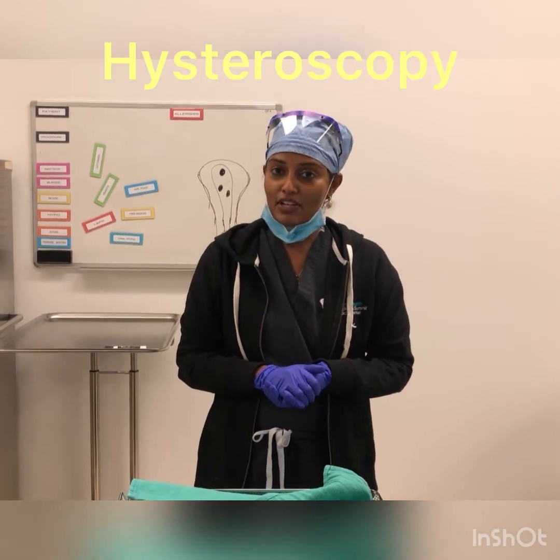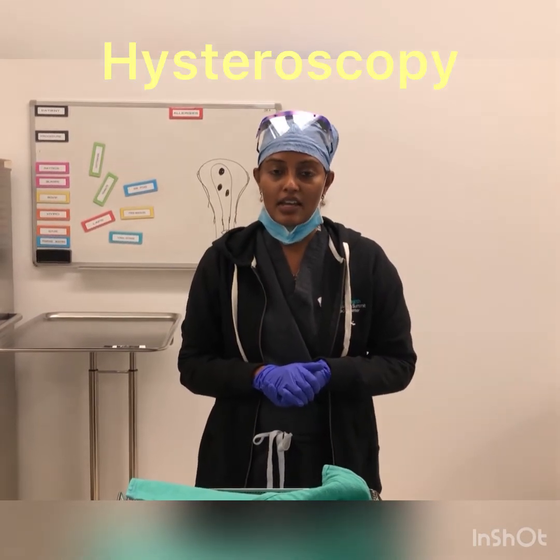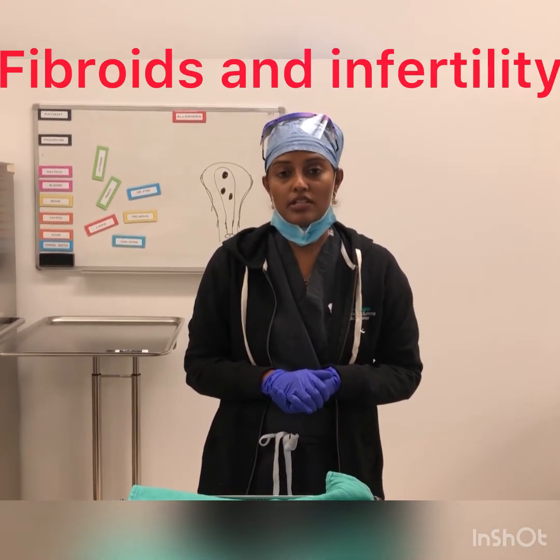So we're doing a series right now on fibroids and infertility. I wanted to show you something really cool in the operating room. I just finished today doing 5 cases of hysteroscopy, so I'm going to go over that procedure. It's a very common procedure done especially for women with fibroids who are undergoing treatment for fertility or who want to get pregnant and who see or find fibroids in the cavity of their uterus.